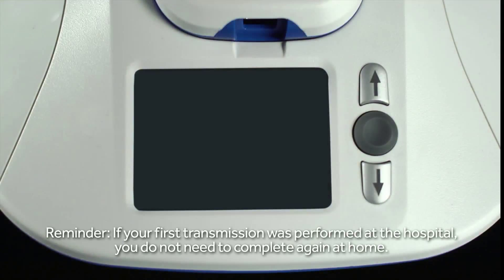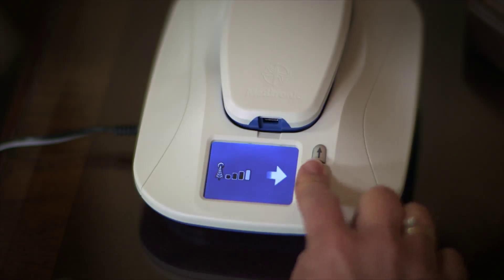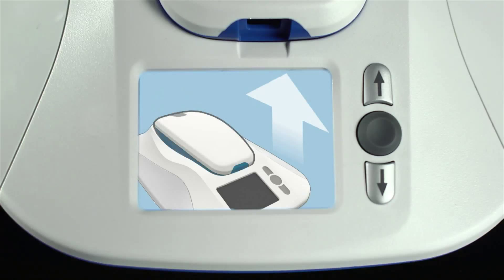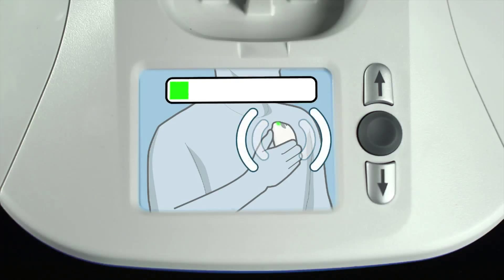Performing a manual transmission is pretty easy, but let's walk through that first setup transmission together. If the monitor screen is dark, begin your manual transmission by pressing the round gray button just once to wake it up. When you see this screen with a white arrow, you're ready to begin. Now push the gray button once more to begin sending the transmission. Lift the reader from the base and hold it over your RevealLink ICM.